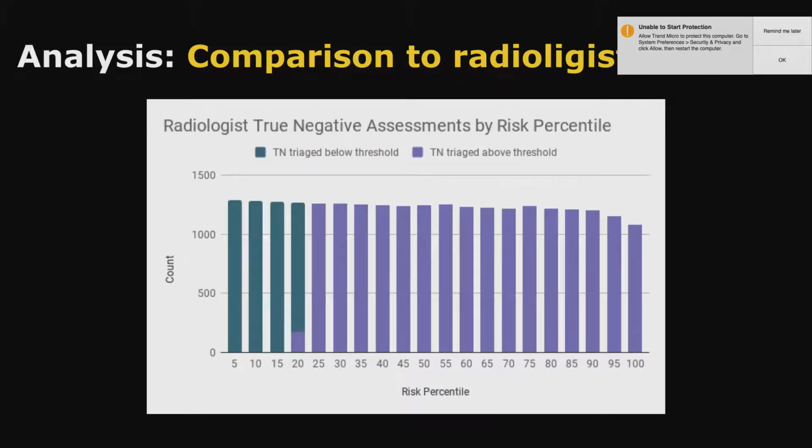And if you look at the true negative assessments, there's not that much trending in where they fall. So it shows that they're picking up on different things, and where they disagree gives us both areas to improve and some ancillary benefits, because now we can reduce false positives.